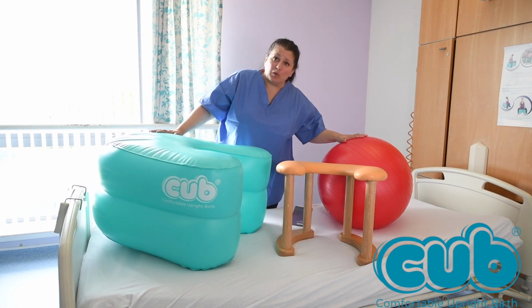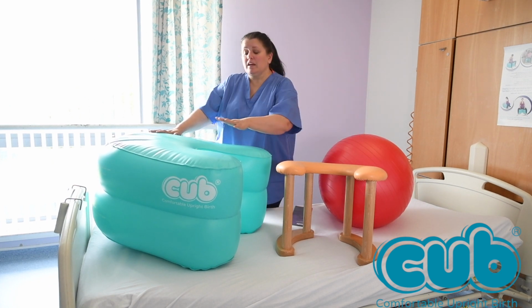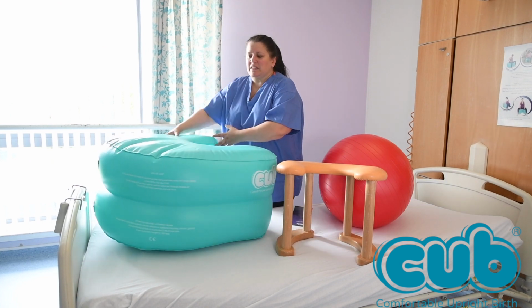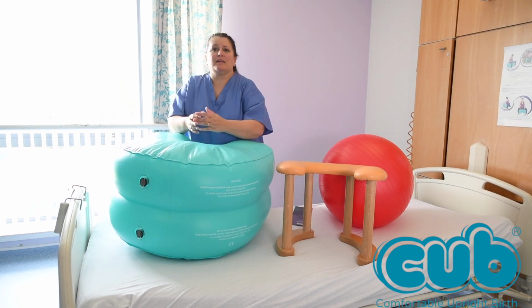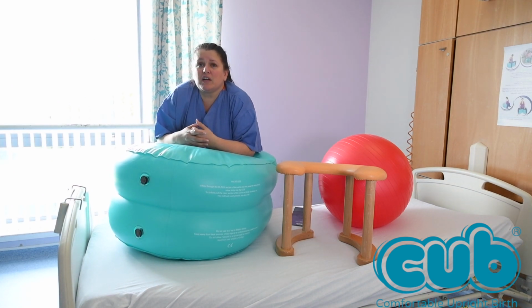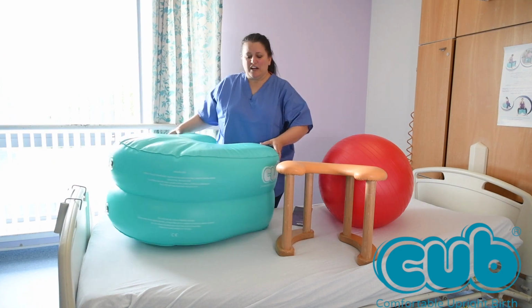You could lean over a ball to birth your baby in that position, but it's not stable. It needs to be leant against something. The CUB is stable to do that, and also it's really great if somebody does birth on all fours and you're behind them, you post the baby up through their legs and they can pick the baby up and rest it here for a minute while they catch their breath and while everybody celebrates the lovely birth of this new person.